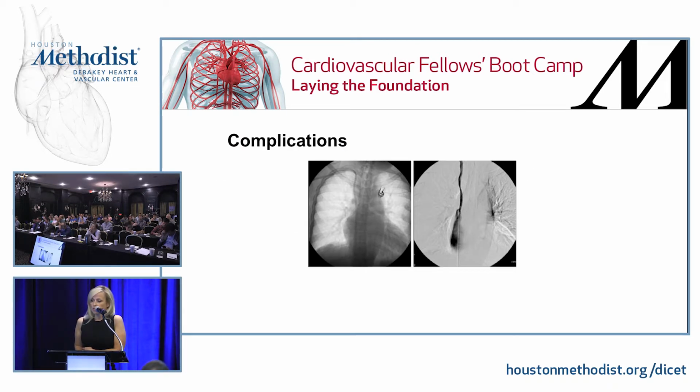So, complications. This is one very common complication that you'll see. You have a catheter. The dialysis unit tells you it's not working, so you change it out. It seems to be fine, and then 2 weeks later, you're getting a call saying that this is not working again. If you shoot contrast through your catheter, you'll find something that looks like this. This is a fibrin sheath that develops over your catheter. If you keep putting your catheter back into this tiny little channel, you're going to have the same problem.